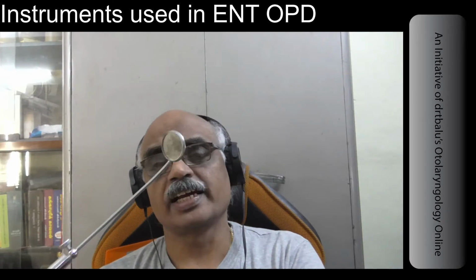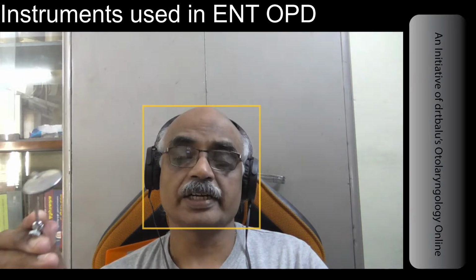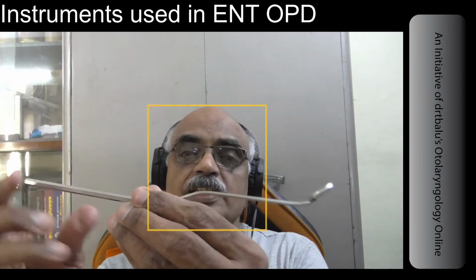Then he realized that mirrors can be used to visualize vocal cords, and this same concept is used by otolaryngologists. You use this laryngeal mirror in your dominant hand to visualize the laryngeal inlet and the mobility of the vocal cords. The next instrument I am going to show you is the postnasal mirror.